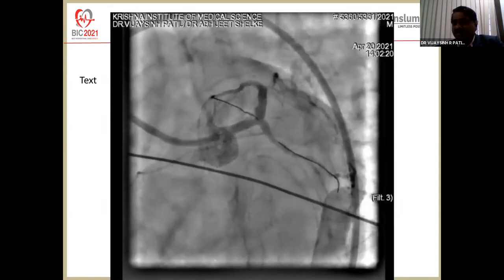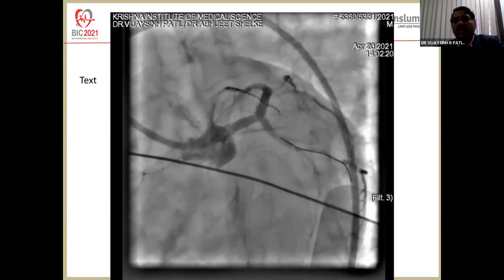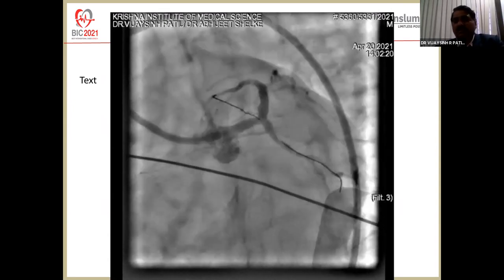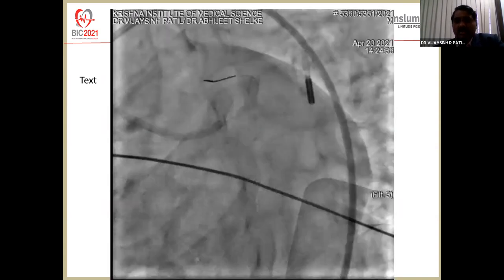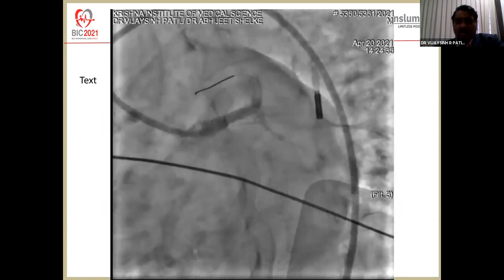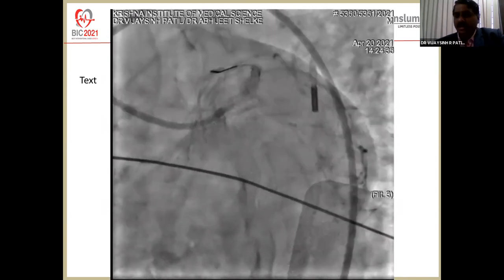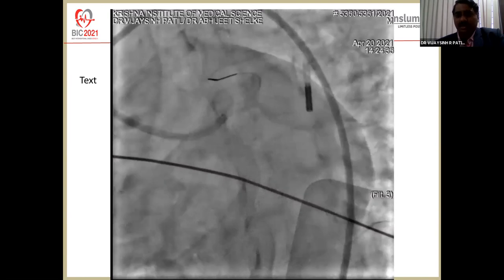Of course, now since we have stented, we decided we will optimize this LAD properly. And we post-dilated the LAD part of the stent with a 4.0 by 8 non-compliant balloon. We realized that this is causing another crash. By this time, we wanted to take a POT for the LM, but we thought that we'll first place an intra-aortic balloon pump because he again started having hypotension.